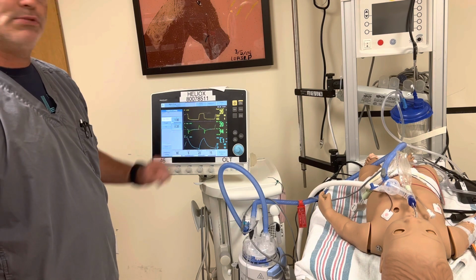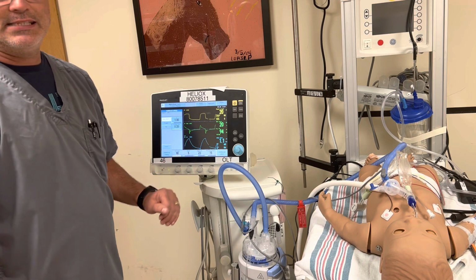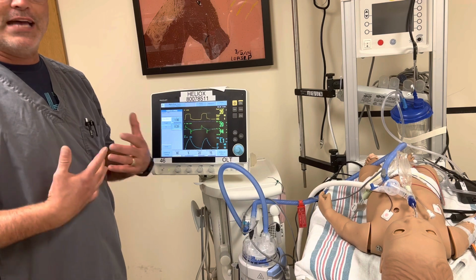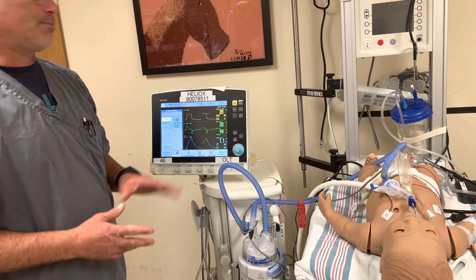You can see it slopes up on the pressure curve. However, the downside to doing this is if the patient should start breathing spontaneously and taking breaths, they're going to want a faster flow rate at the beginning of their breath, and they'll start dipping this pressure curve on it.